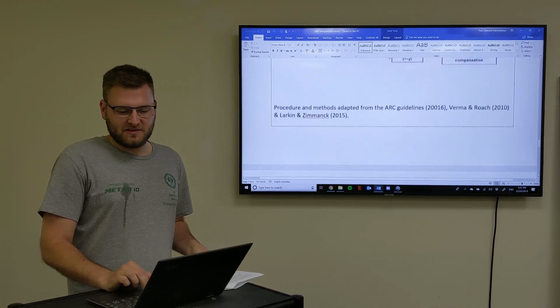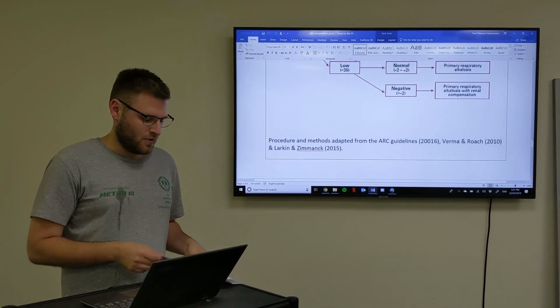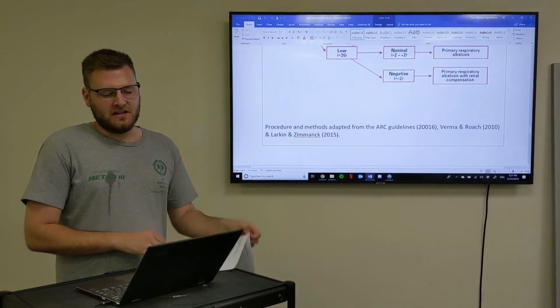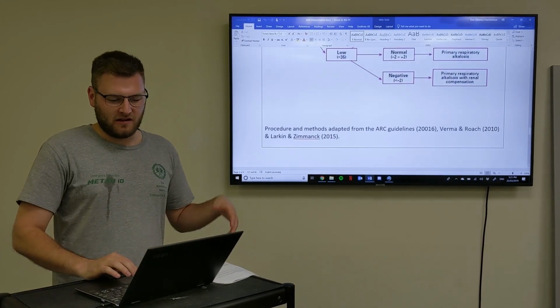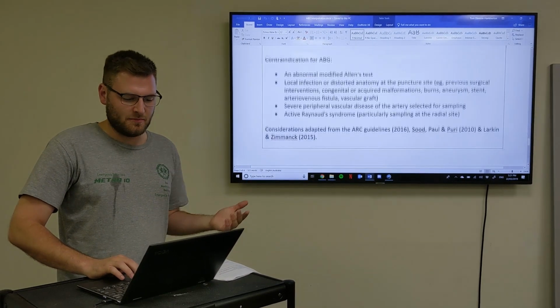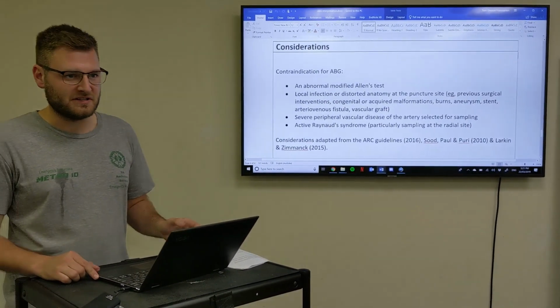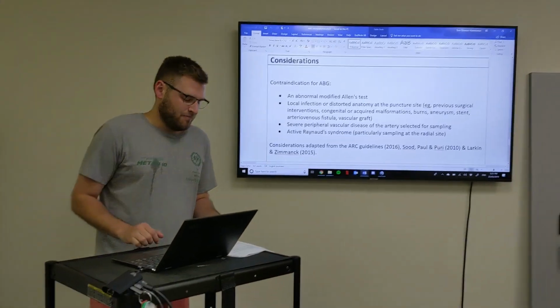We can then use this information to tailor treatment as required. This can also be combined with other information like hemoglobin counts, white blood cell counts, lactate, and so on, to give you a clinical picture of what the presentation is.